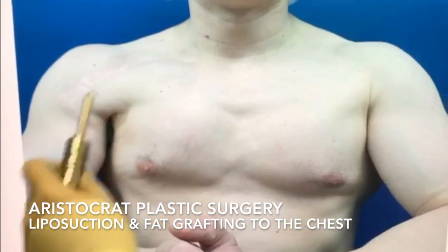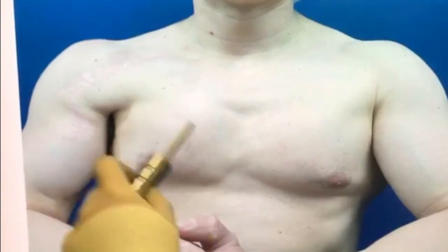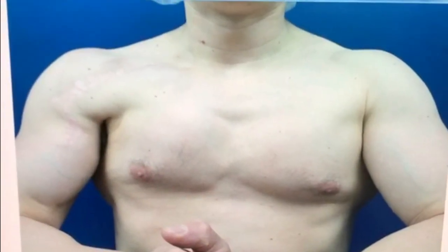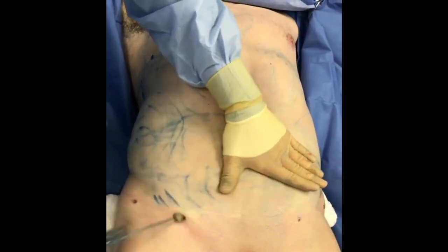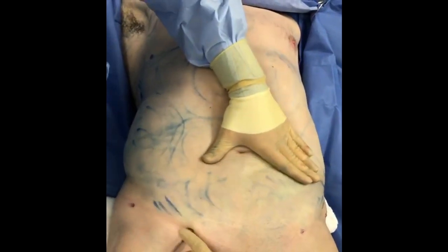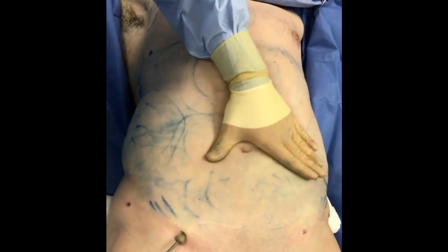This gentleman had a pectoral major tear when he was working out. It was repaired but he has an asymmetry and the right side of his chest is much smaller. So we're going to fat graft it today. We're going to sculpt his abdomen, love handles, and flanks, and prepare the fat for purification and putting it back into his right chest.